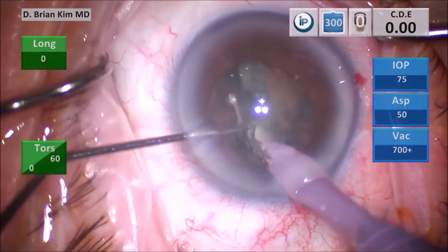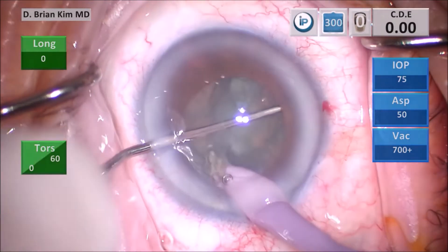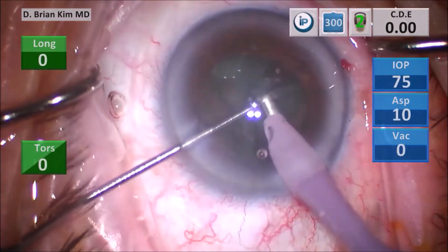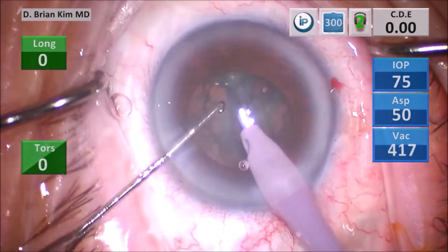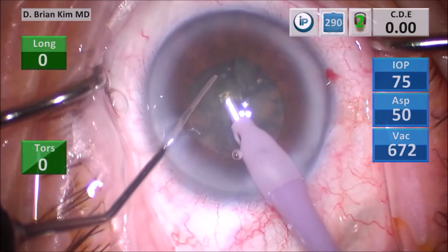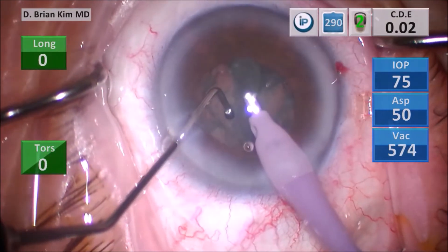I place the chopper out to the contralateral equator, pull the chopper centrally towards the phaco tip, and this crushes the right-hand nucleus. Now I have three separate lens pieces, and I'm able to go after the quadrant in front of me. I place the chopper out to the equator, pull the lens up, and then crush the lens pieces into smaller bite-sized pieces, using vacuum to remove the lens material.